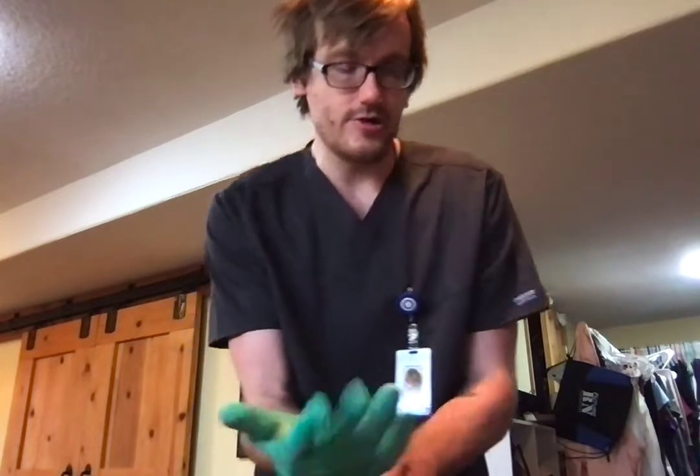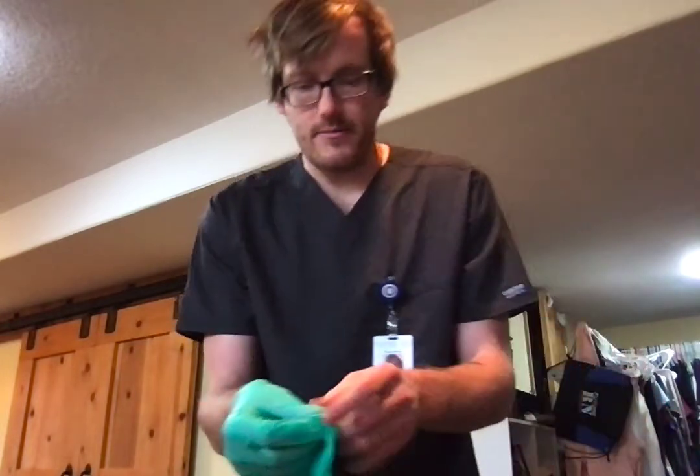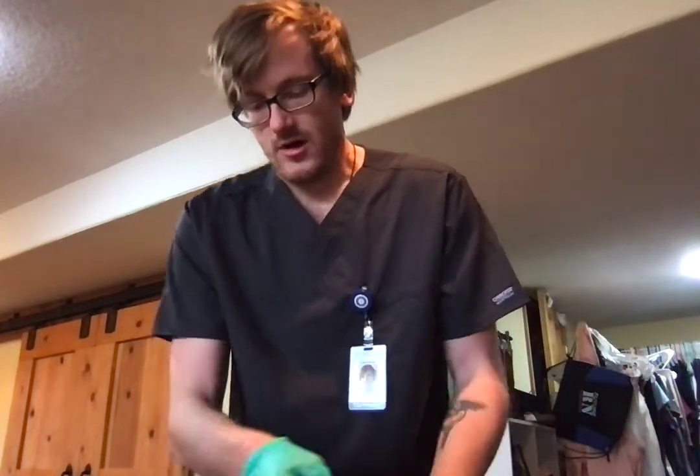The directions that were stated were to just redraw the medication, so I'm just going to start with that. I'm also going to be mindful of the 6 patient rights: the right patient, the right time, the right medication, the right dosage, the right route, and the right documentation.